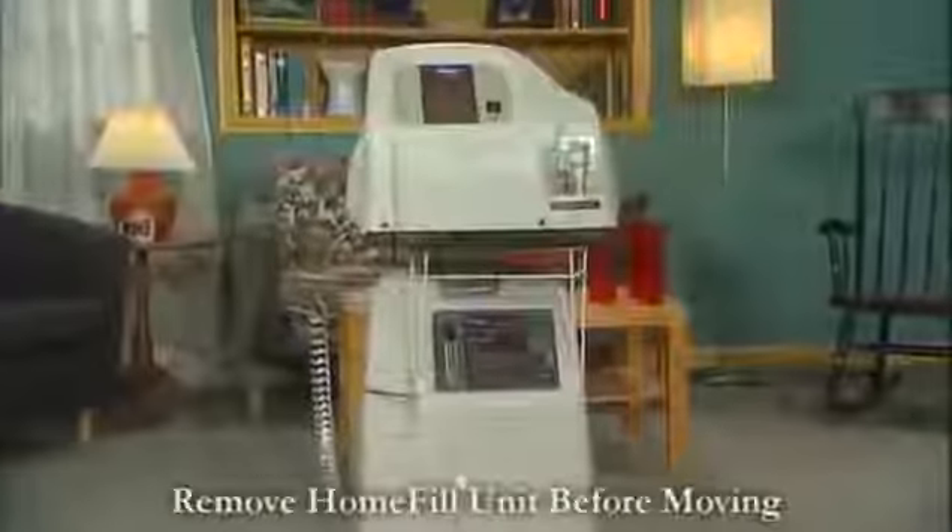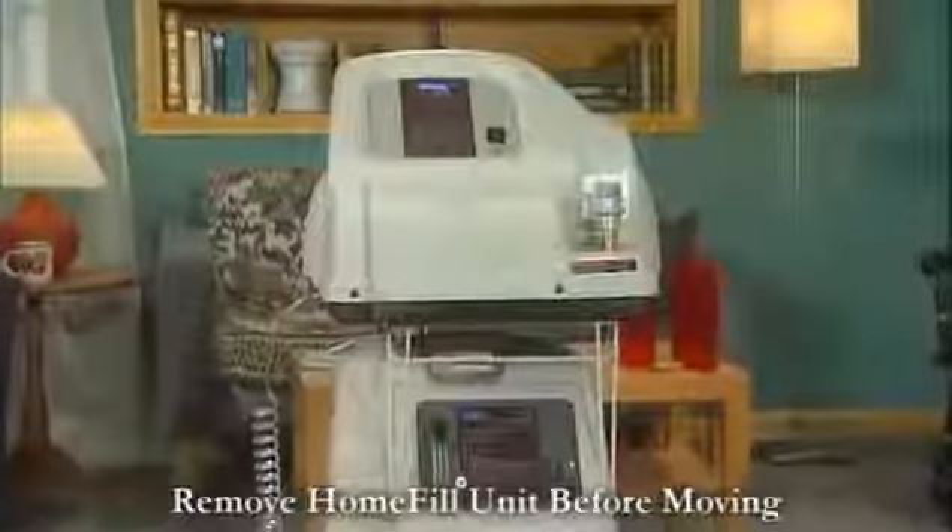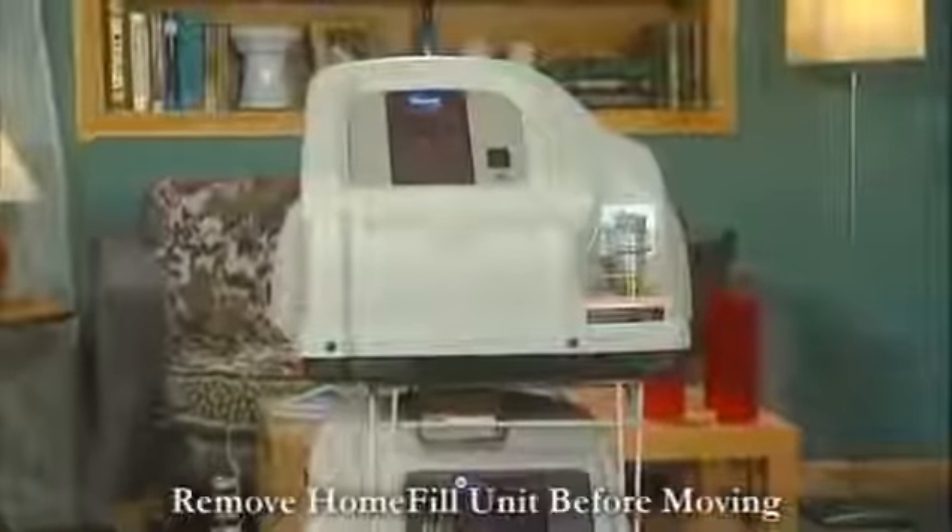It is important that when the concentrator is moved, the home fill unit is removed from the ready rack on top of the concentrator first.